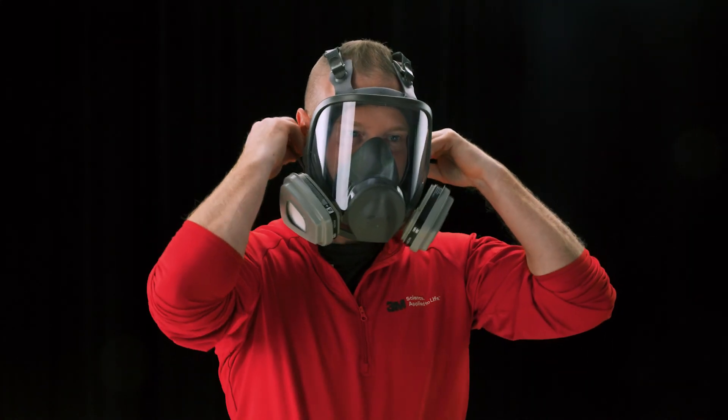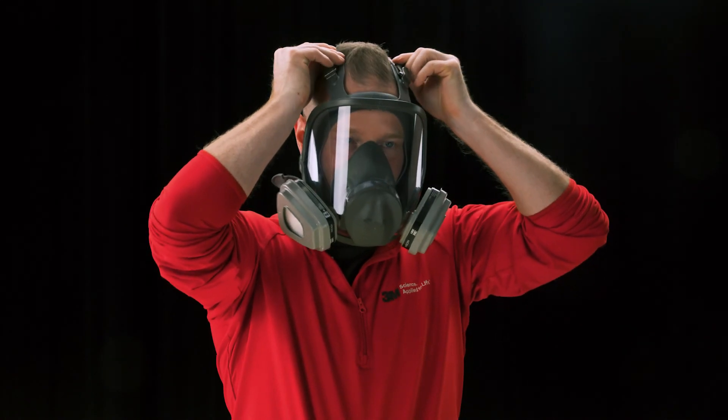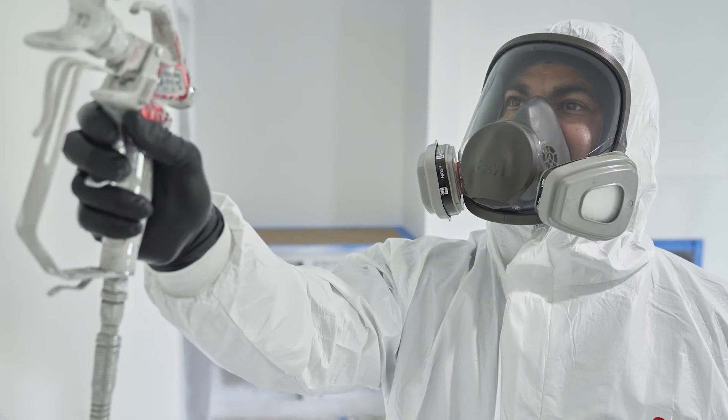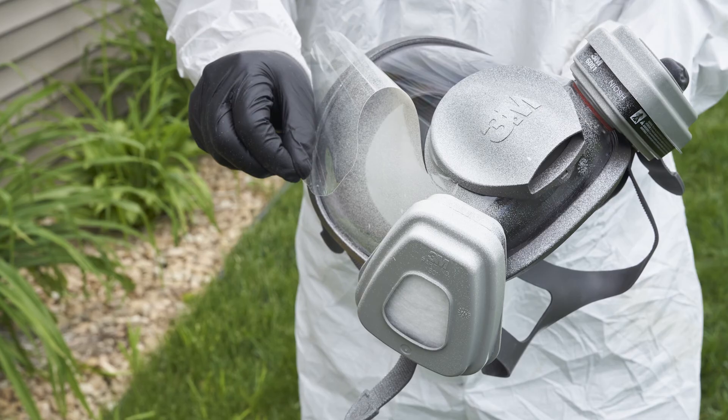Wearing a full face piece respirator helps provide a wide field of view and more facial coverage. Plus, you won't need to wear any additional eye protection. Some models like this one have accessory lens covers that are great for jobs like spray painting. If your field of view becomes obstructed, simply peel away the lens cover to improve visibility.